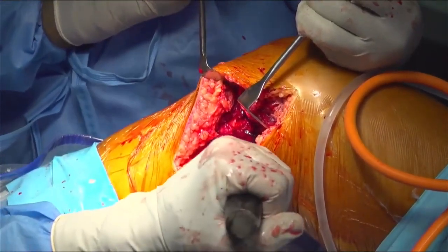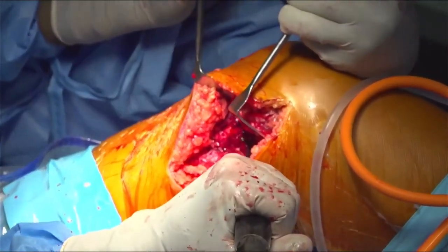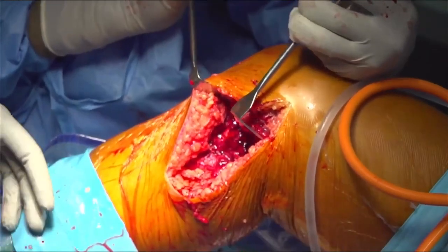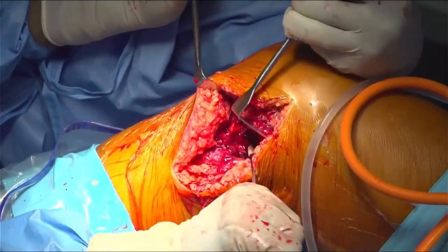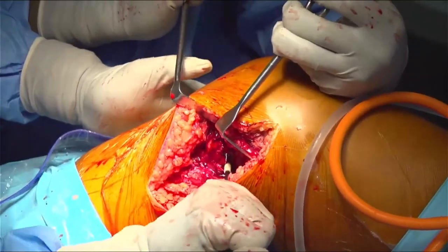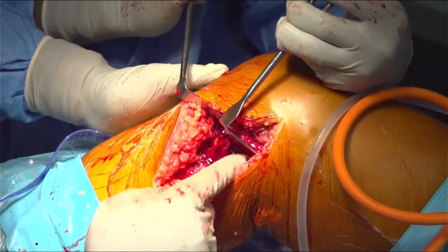Hammer please, anchors please. So we will do it from posterior to anterior. We will put 3 anchors. Hammer please. Inserter please.